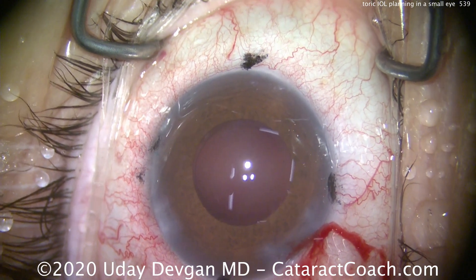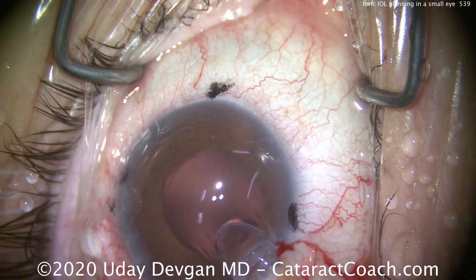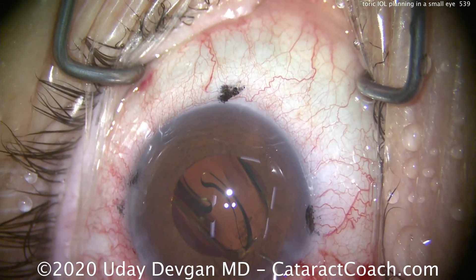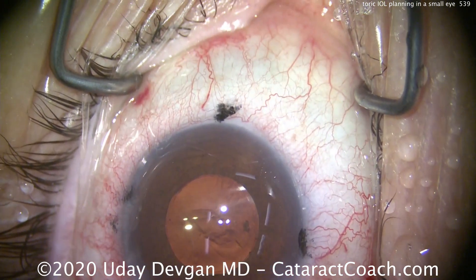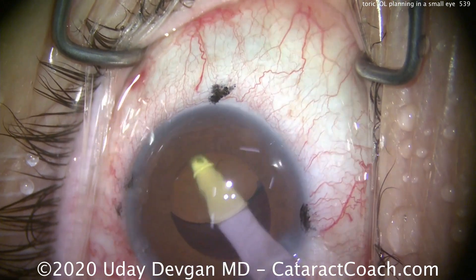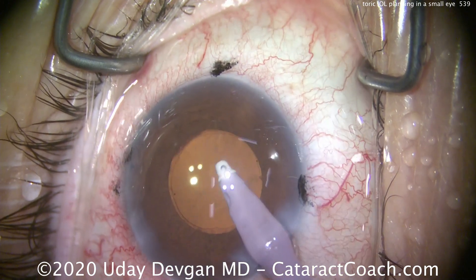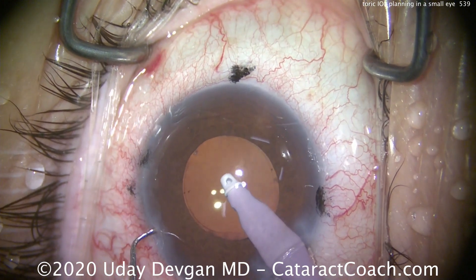The lens is 29.5 diopters with 3 diopters of cylinder correction on the IOL — that lens is very thick. It is safest through the B cartridge, which is a bigger cartridge that requires a 3mm incision, so we enlarged our incision. Now we place the IOL inside the capsular bag and rotate it to about one or two clock hours before our intended axis, because this lens rotates easily clockwise. Get behind the IOL optic and remove all the viscoelastic — if you leave any viscoelastic on the posterior surface of the IOL it will cause it to become slippery and may cause malrotation. Very important: remove all that viscoelastic from the posterior surface and also clean out all viscoelastic from the anterior segment.